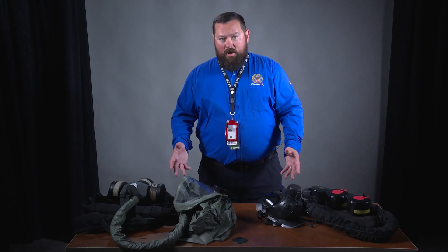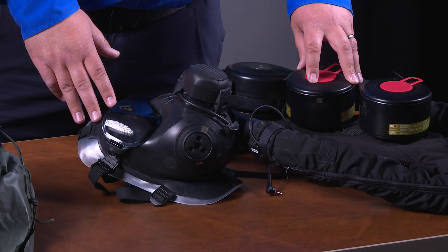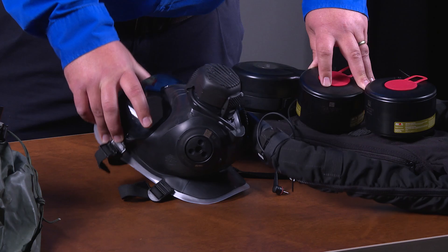I want to introduce you to two masks, one of which you may have seen before: the Dover Sentinel XL PAPR, or Powered Air Purifying Respirator, and one which you have likely not seen before, the Avon MPPAPR, or Multiposition Powered Air Purifying Respirator, with C50 face mask.